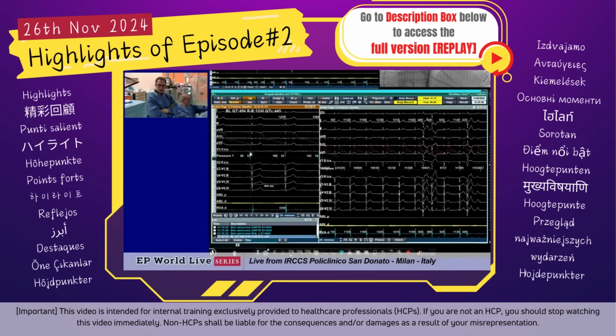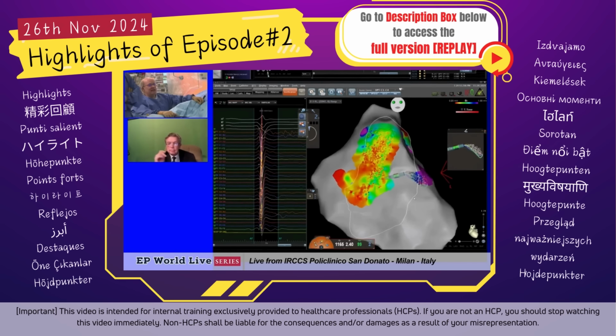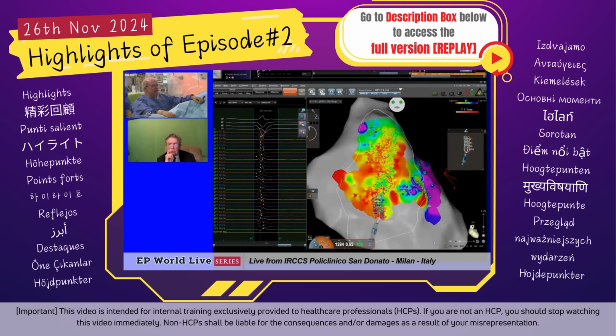Focus on the ECG, okay? The QT is about 500. See here, we have the normal potential in the left ventricle, Frank, see? Extremely tall potential. See in this region, Frank, I am very surprised to find this type of low activity, corresponding most probably to not detectable fibrosis using the best imaging technology.